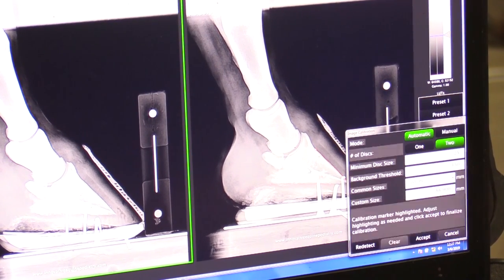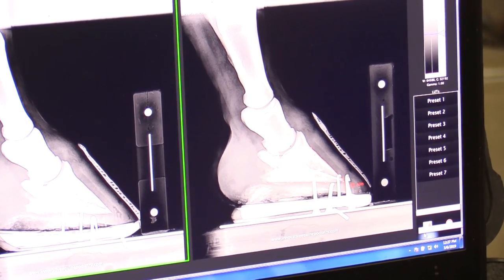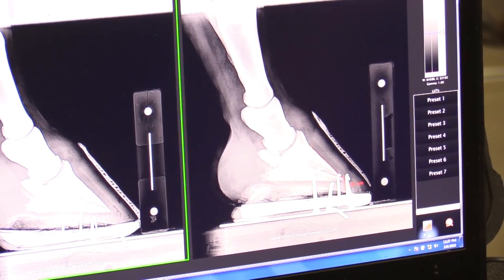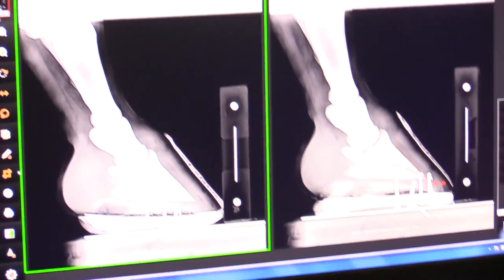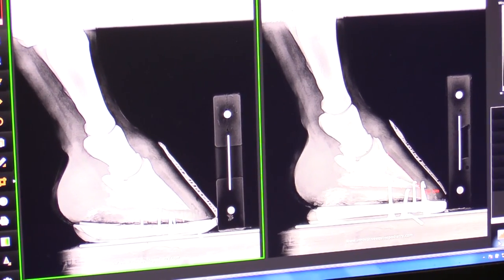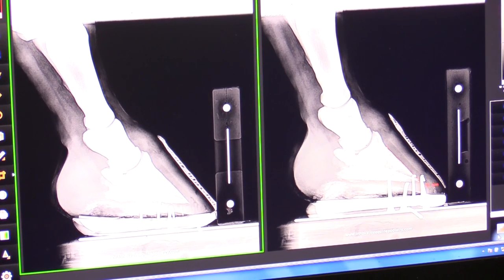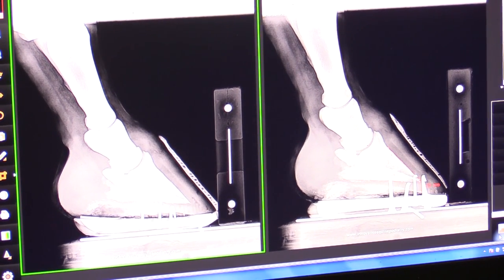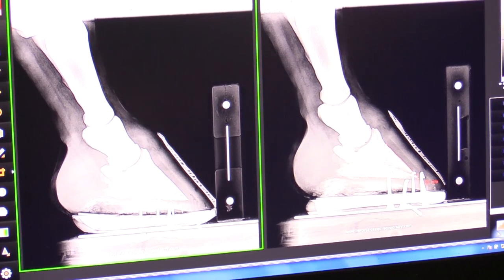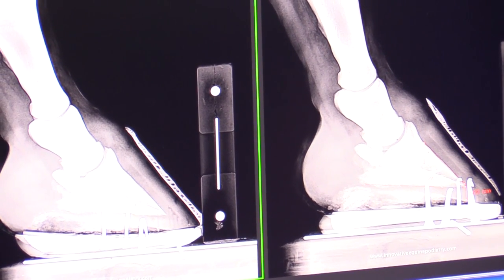So you see that little marker in all my radiographs, the two dots. There are two systems out there that have an automatic calibration. There's automatically magnification in every X-ray because what we're measuring is that far off the plate. Just like if you put a flashlight against your hand and your hand's right against the wall, you get a silhouette or a shadow of exactly what your hand is, pretty much. The closer you bring your hand to the flashlight, the more magnified that image is. So in every radiograph, there's at least 10% magnification from the center of the hoof to the radiograph plate.